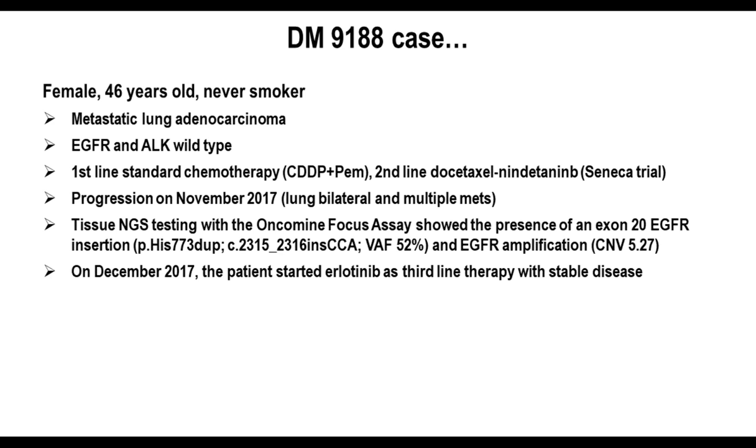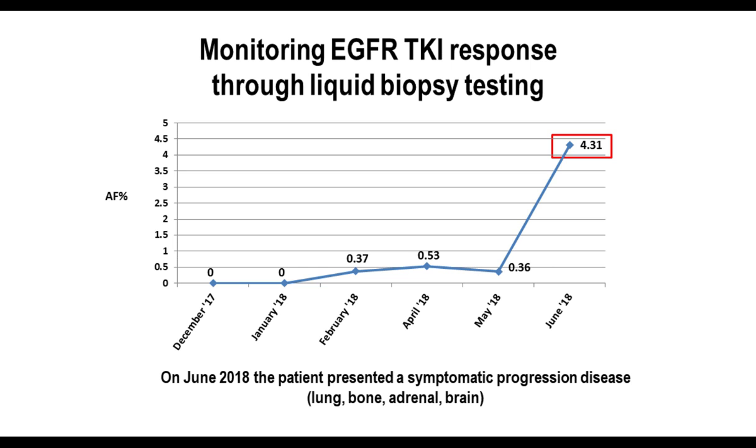Now, based on these results, we started the treatment, and we started to follow the response to treatment on liquid biopsy. We usually do this in those cases in which we have a rare EGFR mutation, because we might not respond to EGFR tyrosine kinase inhibitors, and indeed, after only 2 months, we could observe a slight increase in the level of the EGFR mutation. We are following this individual using the target sequencing panel, the cell-free assay, because this mutation is not covered by standard kits and not even by our digital PCR assay.